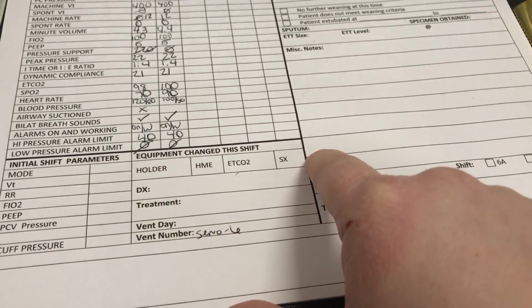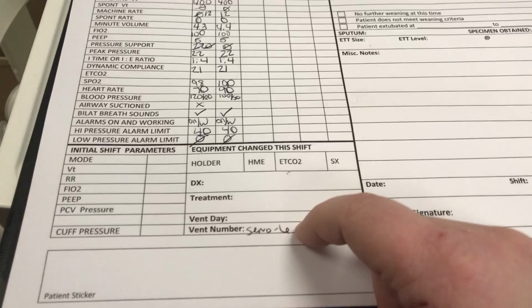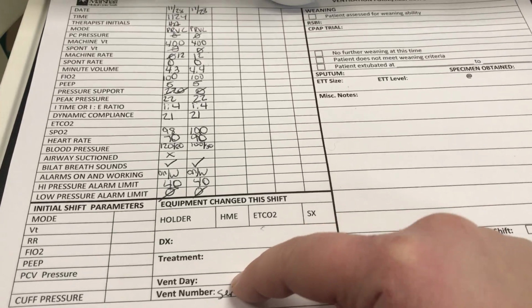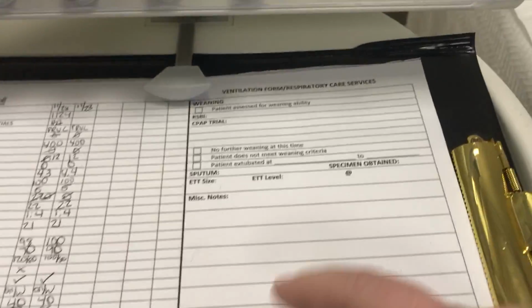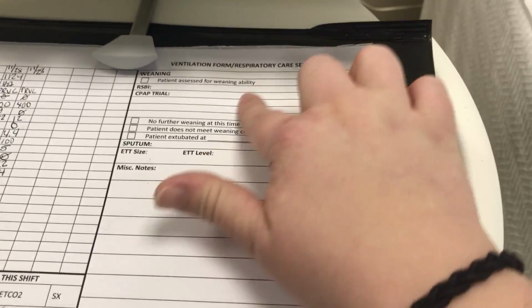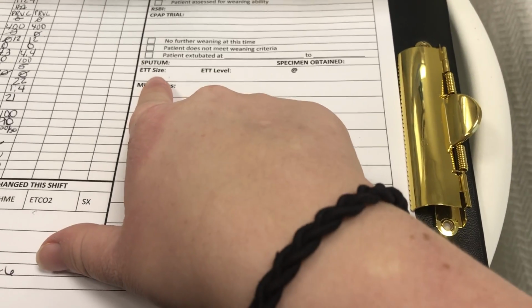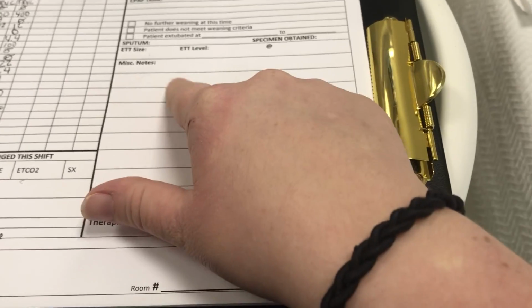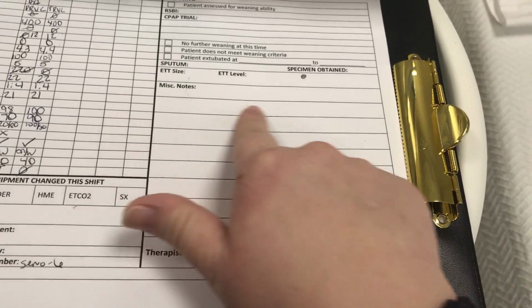If I changed any of the equipment, I would circle or check mark the patient diagnosis, treatment, the vent day they're on, and the machine number. If I did a weaning trial, I'd fill this section out. ET tube size and level, I'd write right there, and the missed notes is if I make any changes throughout the day, I would write them here and change them.